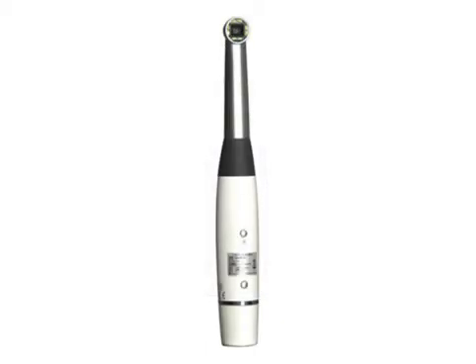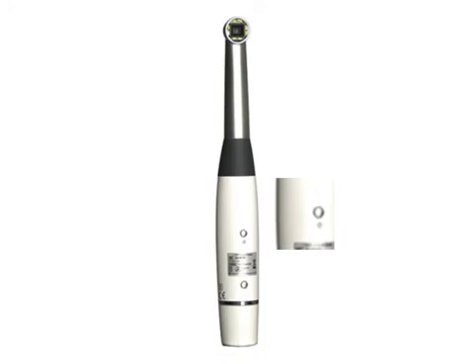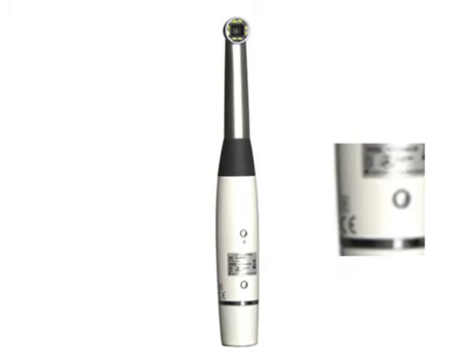On the other side are the camera window, the power button, and the cable/battery release. The camera window is the part through which images of the patient's dental anatomy are captured. Eight white LEDs illuminate the area to aid you in locating the area of interest and provide sufficient light for capturing stills and video. The power button turns the camera on and off. The cable/battery release is pressed to remove the cable or battery from the camera.